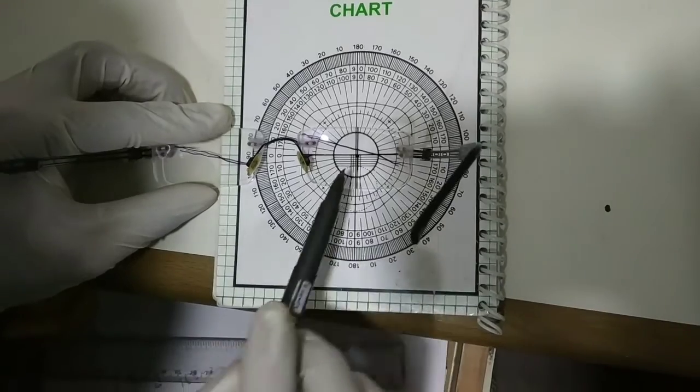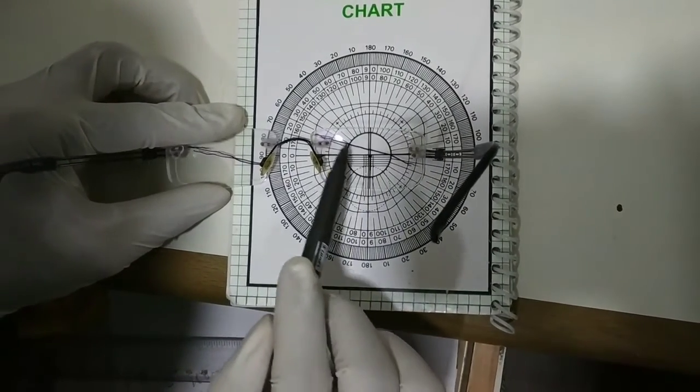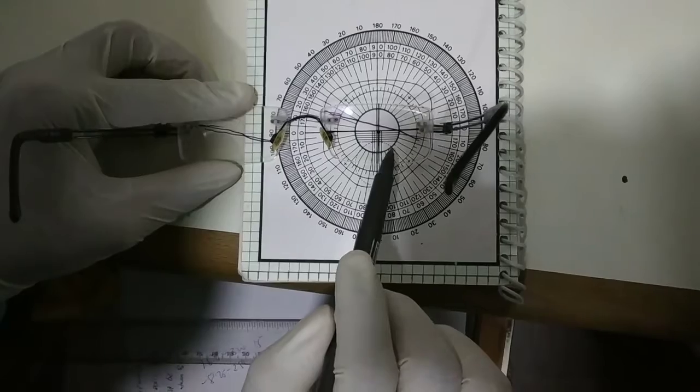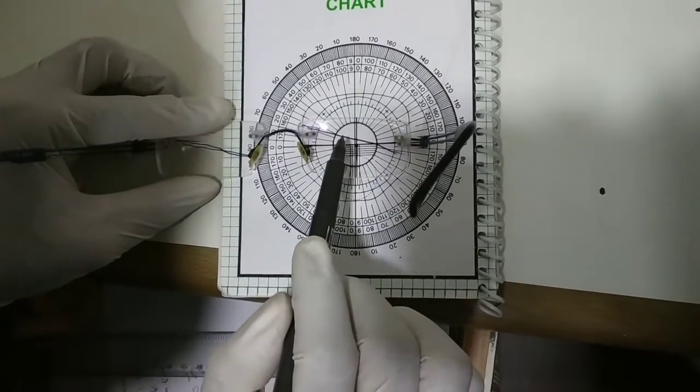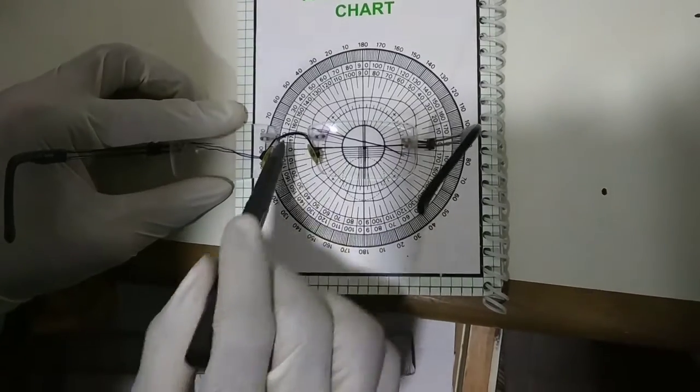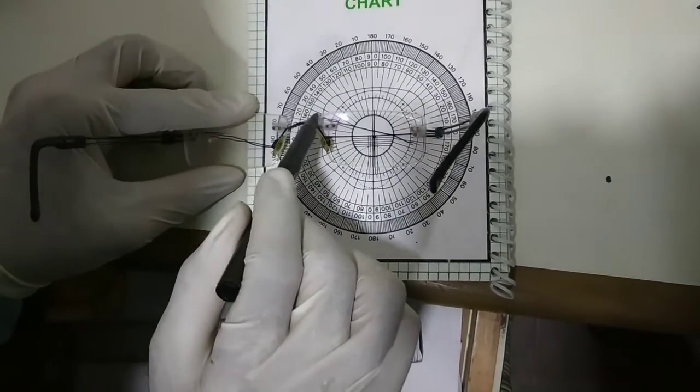You can see the vertical. After that, you have to see which mark for that axis. You can see the cross and the line which is matching there. It is around 25. The upper is for the right side, and the lower mark is for the left.